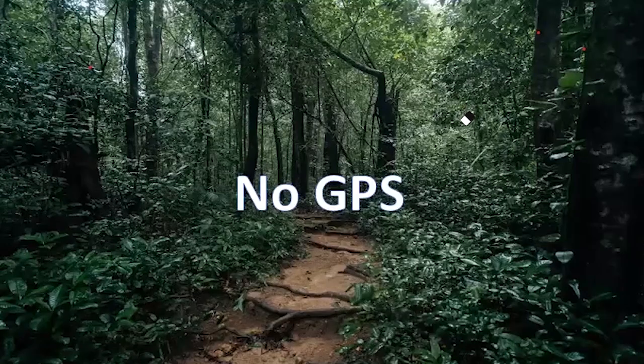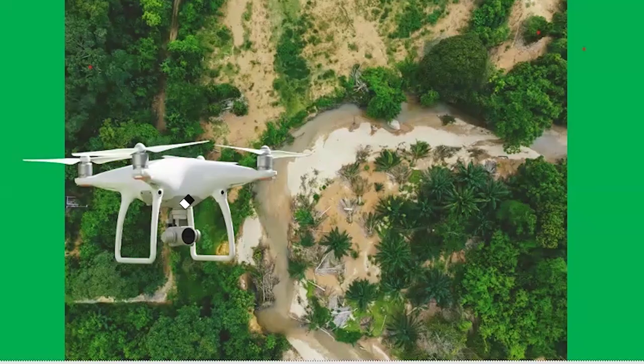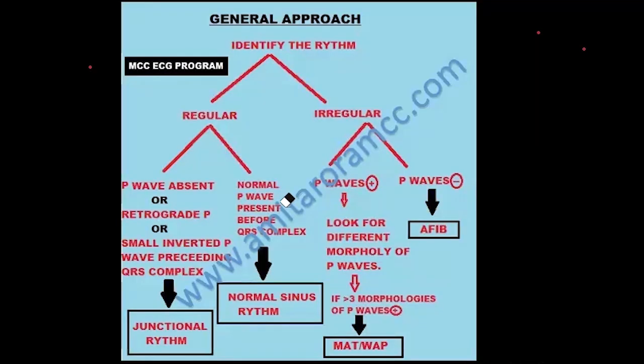Suppose you go hiking with all the necessary stuff for survival like tent, food, everything, but you are missing the GPS. There is no GPS. You won't be able to navigate further. This is a proper roadmap, like a GPS. You need these kinds of flowcharts to interpret ECG in a systematic manner.